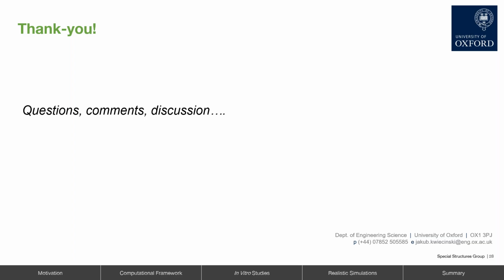Yeah, great question. So I think this research, from our end anyways, was quite exploratory. So kind of proof of concept from our side, collaborating between engineering and in the hospital. And what we were really focusing on here were those structural interactions. And although in the in vitro model, rather, we had things like flow and a pulsatile system there, where this study is limited is the specific fluid flow aspects associated with gutters and endoleak and things like that.